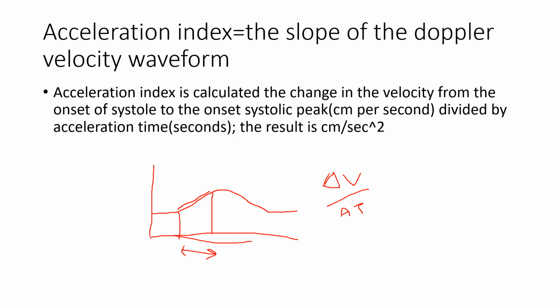Imagine if you find it in the segmental arteries, in the renal artery, you find that there is a proximal artery stenosis in the renal artery. If it is proximal, it is atherosclerosis; if it is the mid part or distal part, it is fibromuscular dysplasia. Or if it is in the CCA, the stenosis is proximal, meaning near the heart.